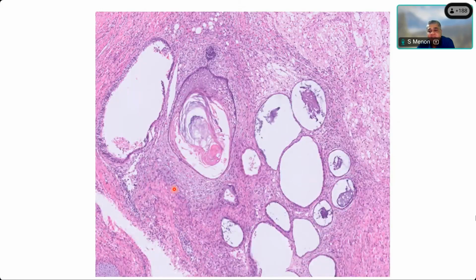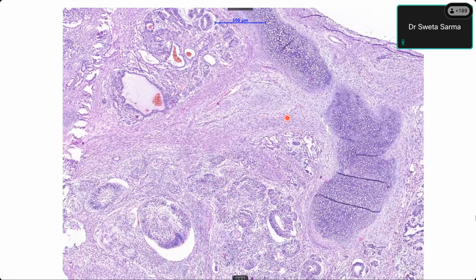Can anybody describe this? Shweta, can you see what this section from the ovarian tumor is? Sir, section shows multiple cystic structures. Very good. Sir, lined by columnar. This is not columnar, maybe a little bit here. Somebody thinks it's Brenner. This is keratin here. So moving on to the next one, keratin is present within the follicles. Very good.